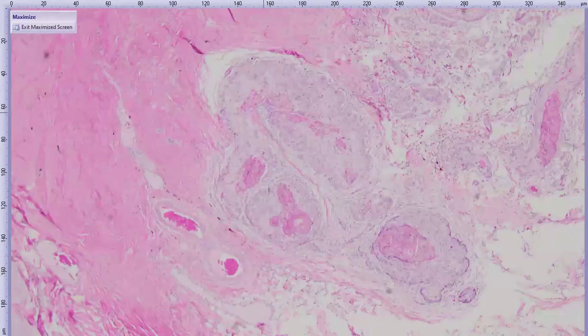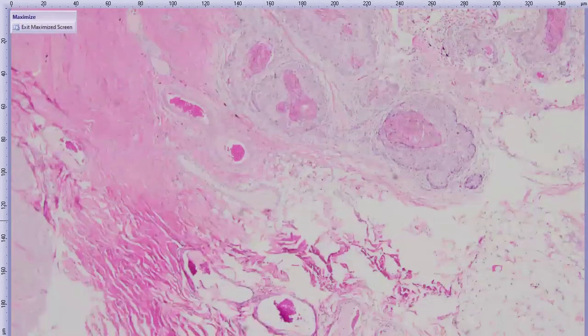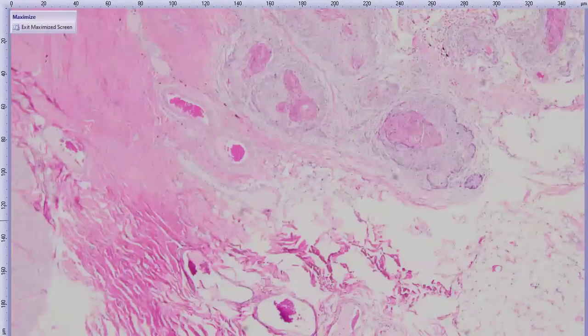It's often hard to make out the endothelium around it, but it's more based on location and the focal round nature of it than identifying it as a vessel itself. Exactly. Yes, I ended up putting suspected vascular invasion because I'm a bit of a weenie, but did warn about vascular invasion in this case. All right.